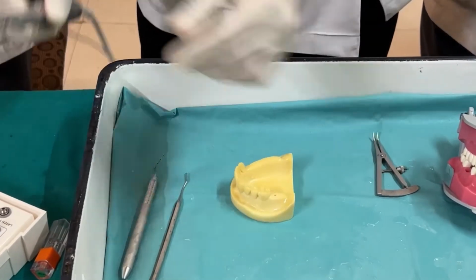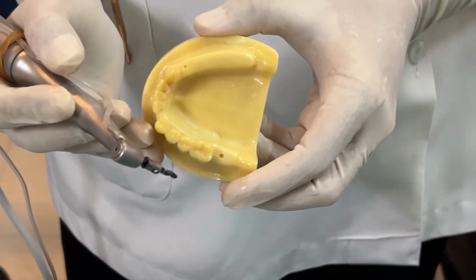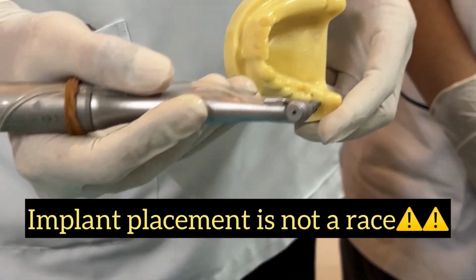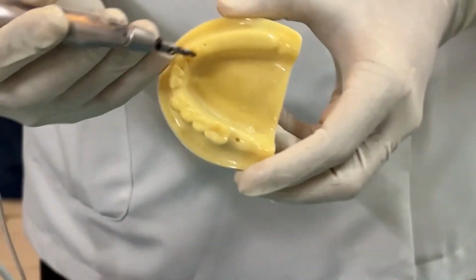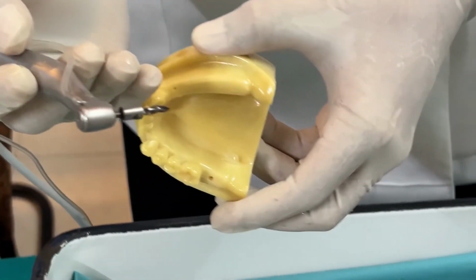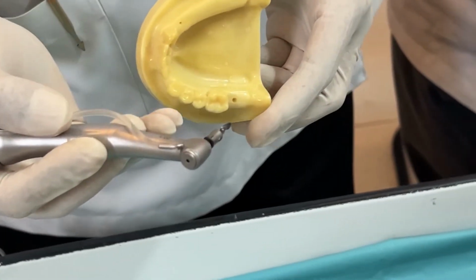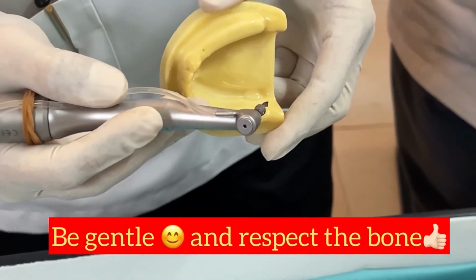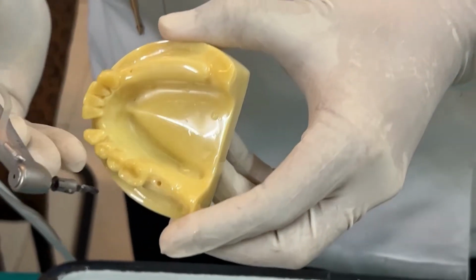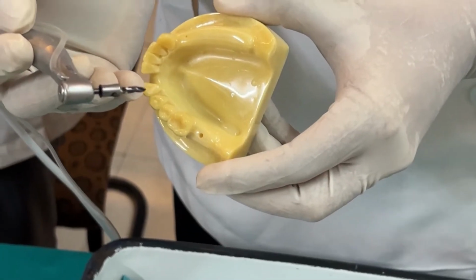The next drill which I had attached was 2.8. Always and always please remember, implant osteotomy preparation is not a race. So many people try to demonstrate, I placed an implant so fast, as if they had to catch a movie or a dinner after implant placement and the patient was also in a rush. No. The more atraumatically, delicately, gently you do it, the more would be the longevity of your implant. Under no circumstances are you supposed to increase the pressure and the speed and unnecessarily cause trauma to bone.